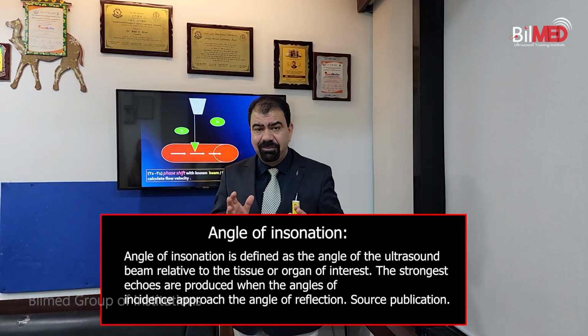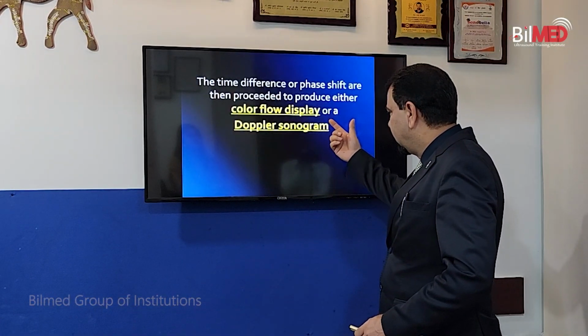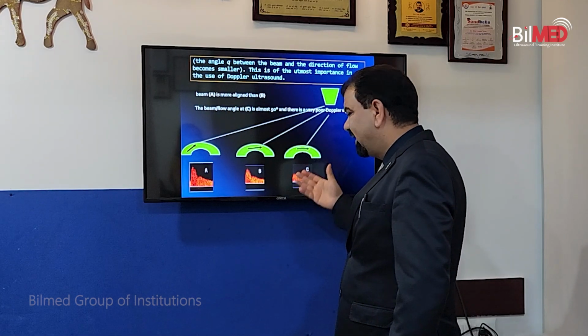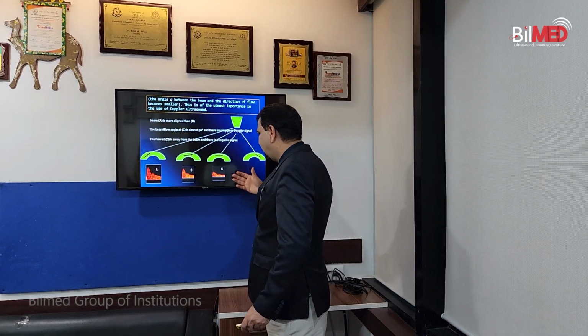The angle of insonation is very, very important. You have to hit with an appropriate angle, and that is the angle of insonation, which has to be less than 60 degrees. So 60 is the cut-off. Now what is the angle of insonation, and how do you take it? For that there is a course, but here we are giving you some basic important points to keep in mind. This angle should be less than 60 degrees. If your angle of insonation is about 90 degrees, you will not see a good color, and then you will be blaming yourself or cursing your machine, asking why the color is not popping up, because you are hitting with a wrong angle. So the angle of insonation is very, very important.